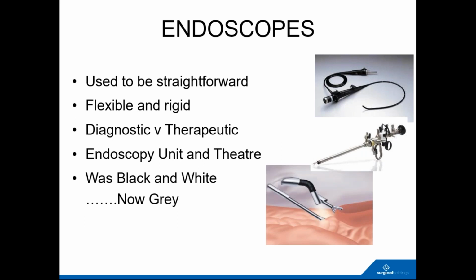To use an example, this is a semi-rigid instrument, which is a flexible tip laparoscope, and so it has a bending section like a flexible instrument. Instead of a normal telescope, which as you will be aware is a rigid straight rod with a 0 degree or usually 30-degree direction of view, this is flexible. It will move around, and so you can go behind a structure and look back on it, or under it and around it, etc.